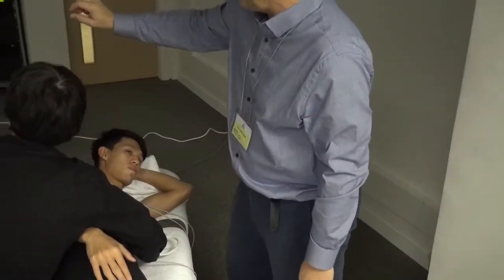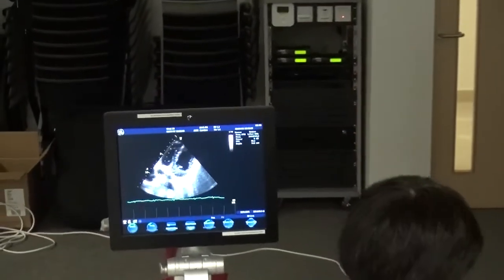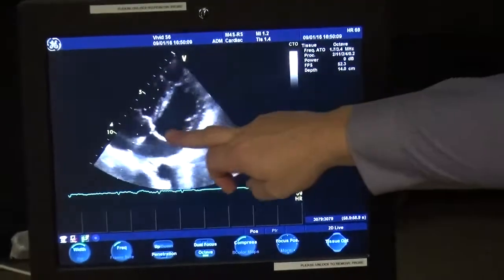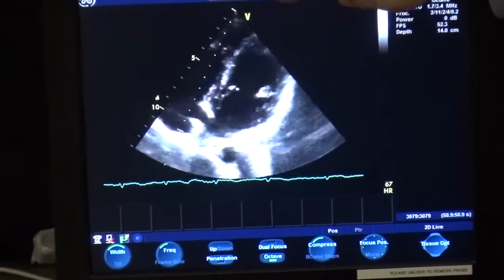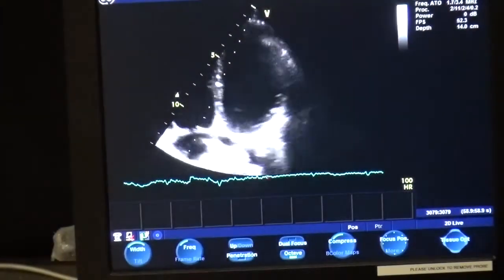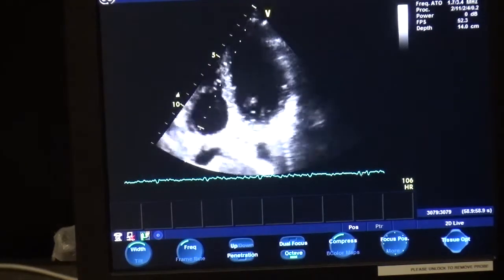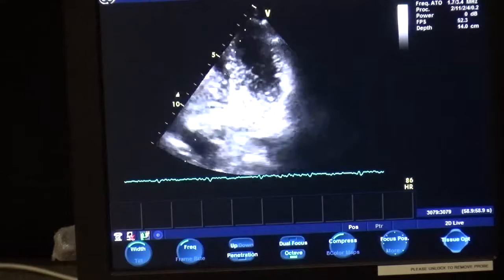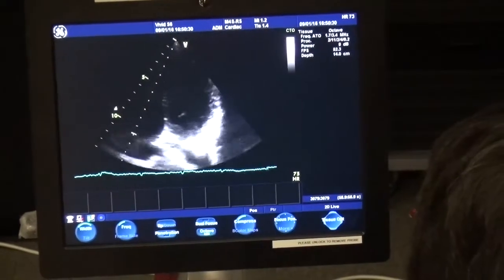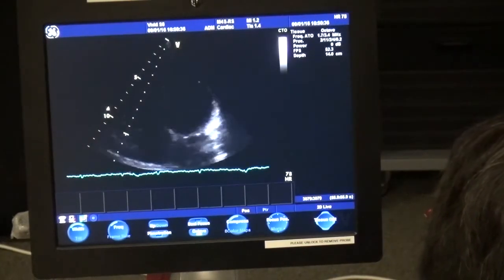At the moment, we're getting ventricle, ventricle, and then it looks like we've got a wall here at the bottom of the ventricle rather than a valve. So there you go. First thing you do is tilt back, and then the second thing is, see it's going up here, so the apex is here. We want it here, and all that means is that it's actually round there. So sometimes you've actually got to move all the way round here to get that apical view. So just tilt back a little bit. Just keep the contact, but tilt back, you'll see the valves coming. There you go.